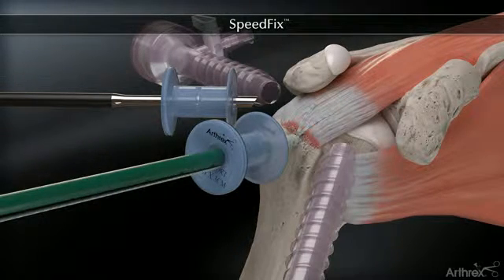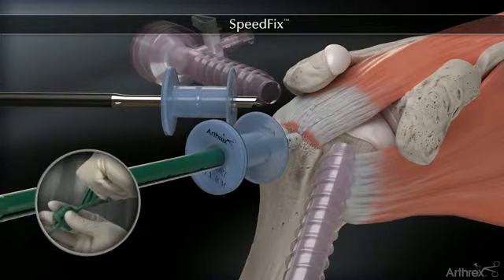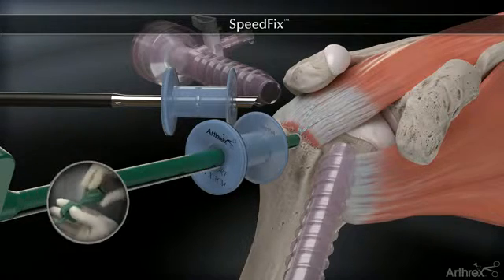The cannulated and vented swivel lock is inserted by holding the thumb pad steady while rotating the driver handle.